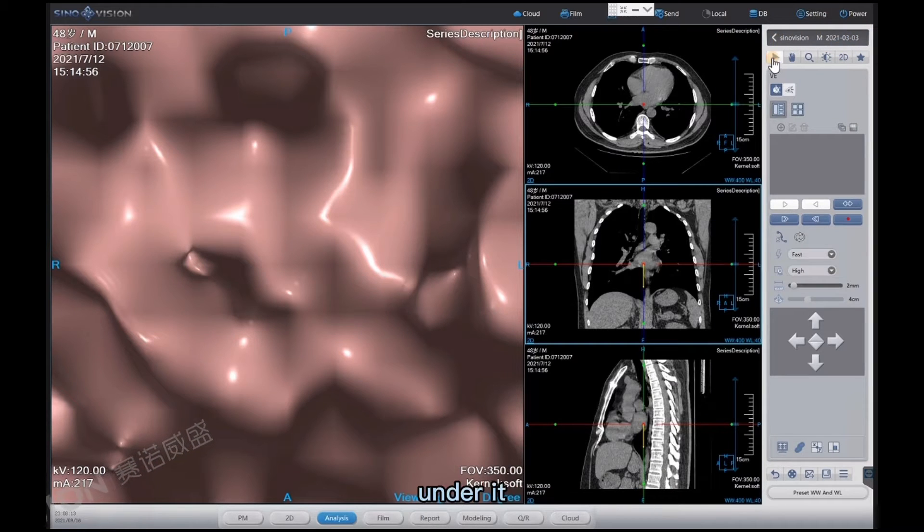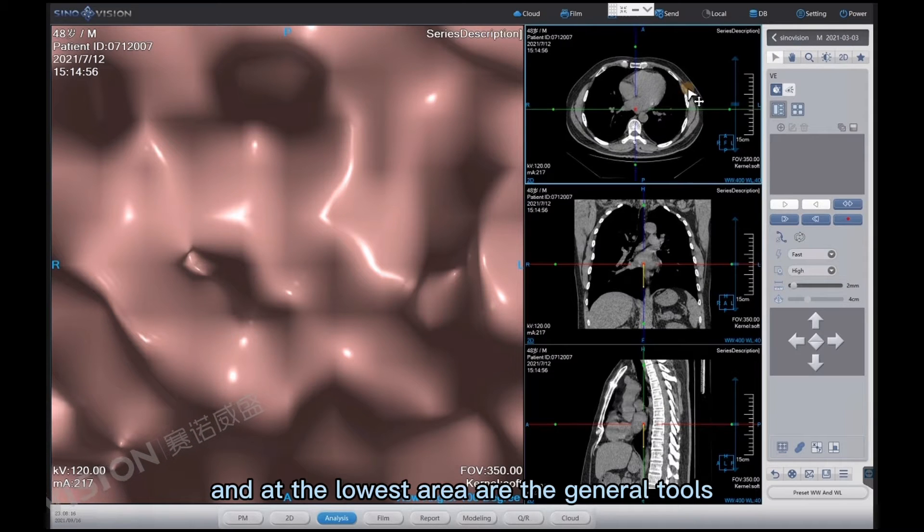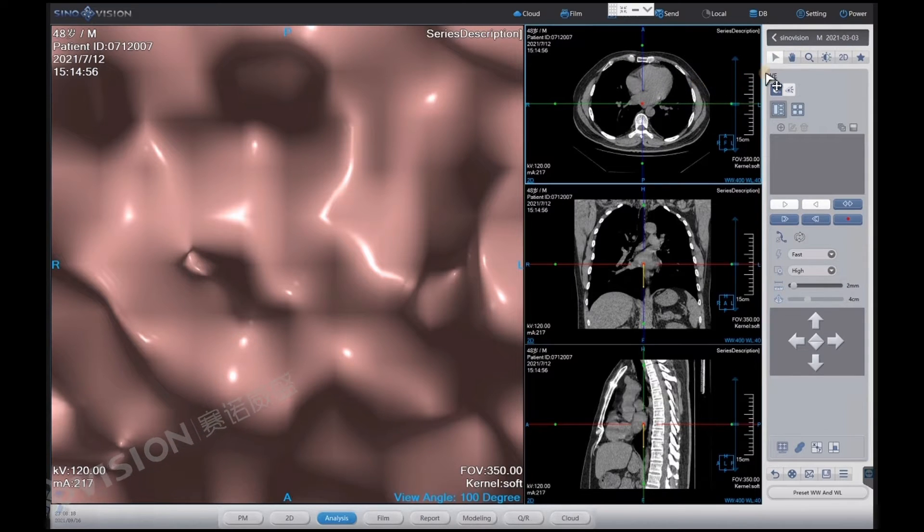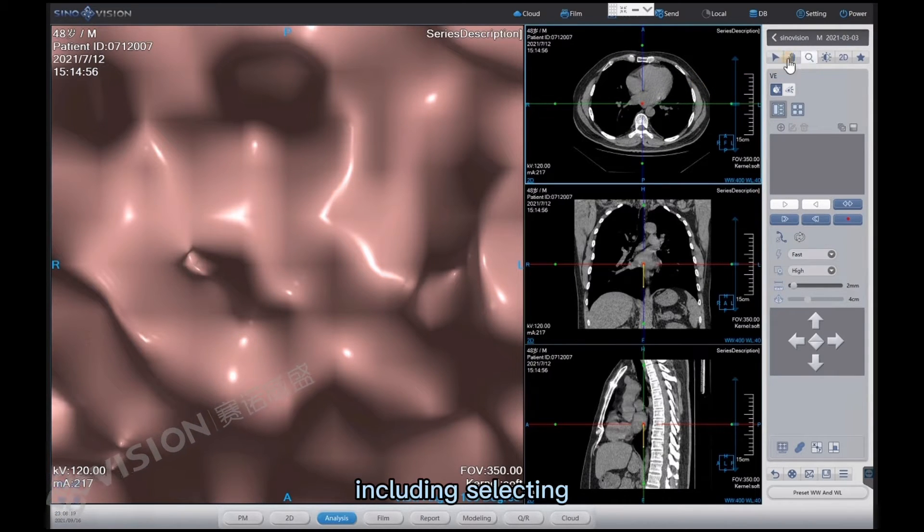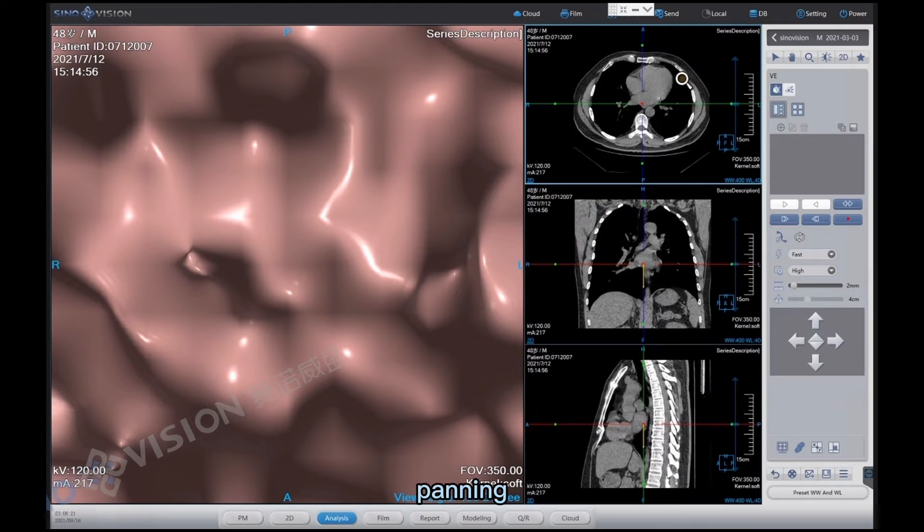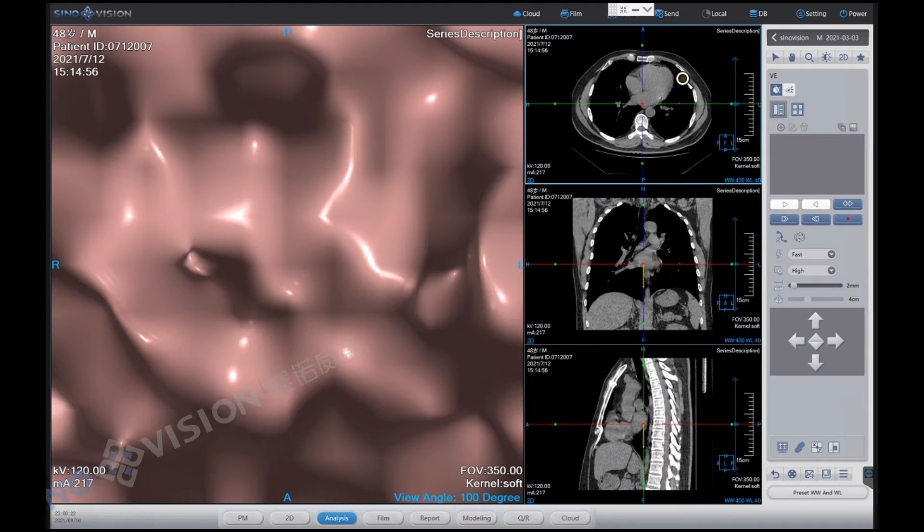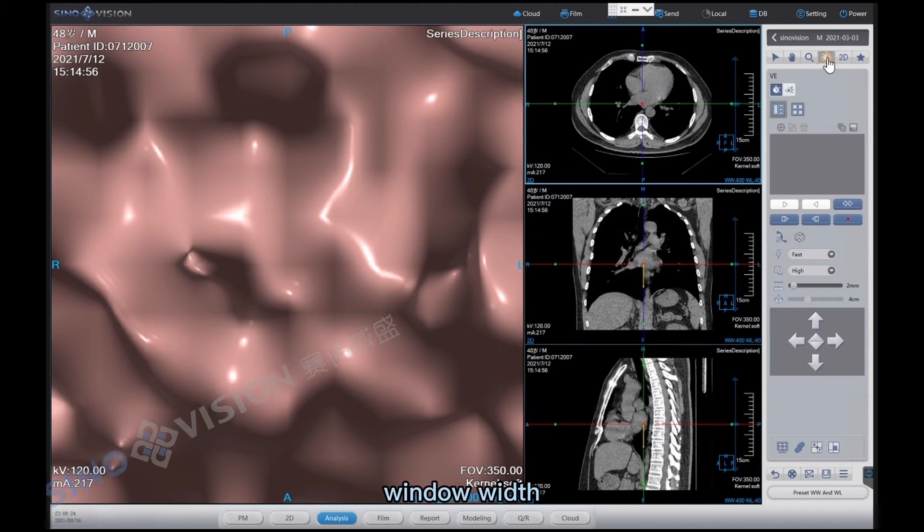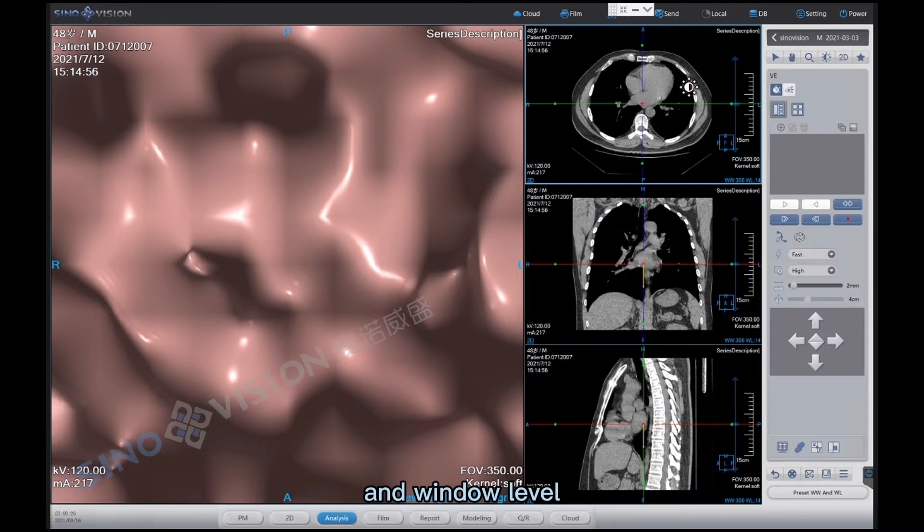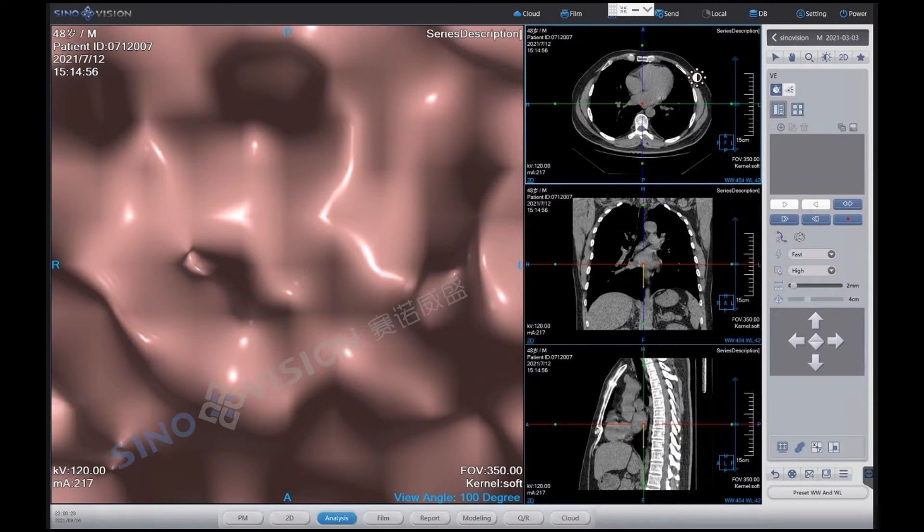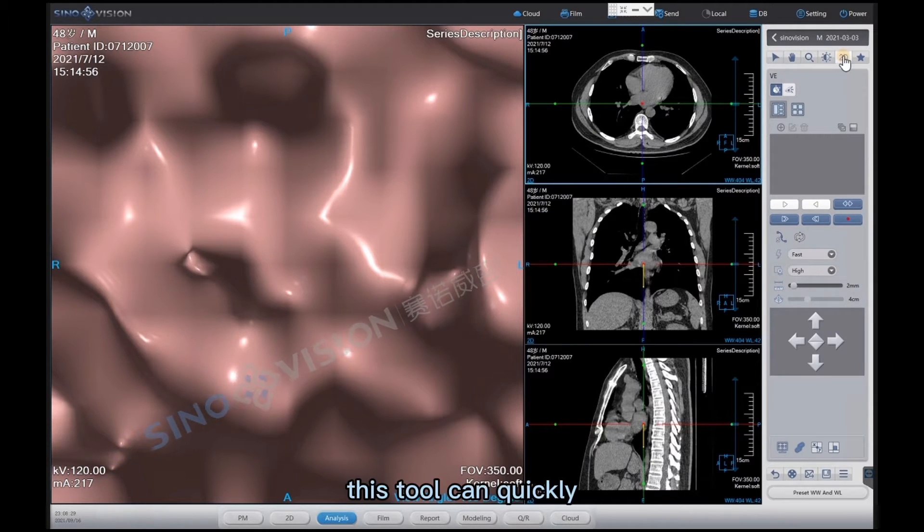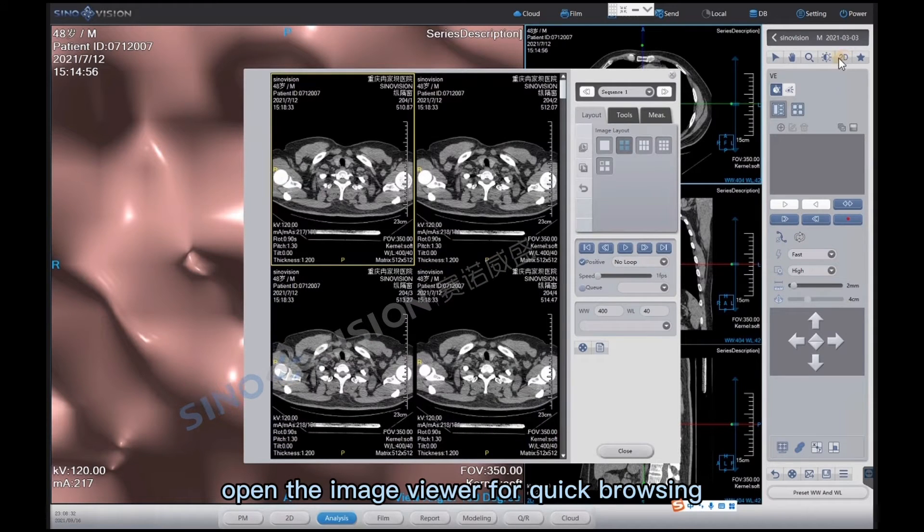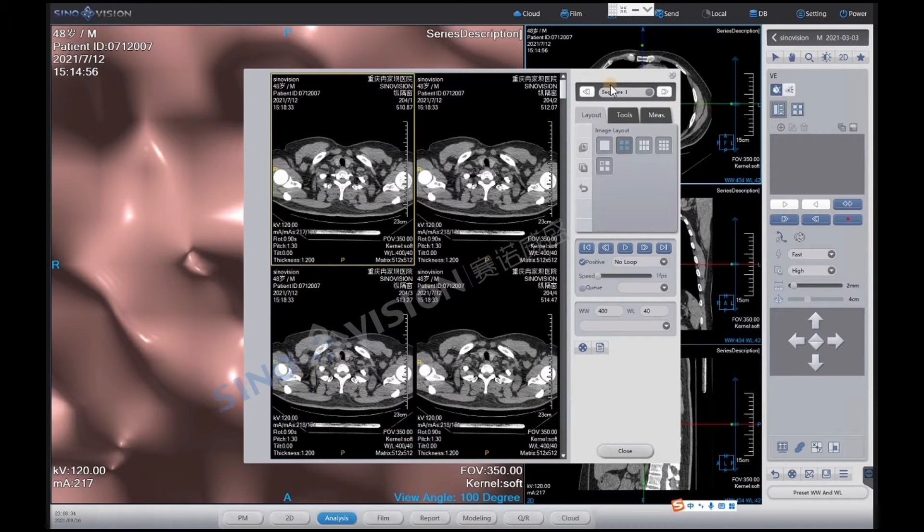Under it and at the lowest area are the general tools, including selecting, panning, zooming, window width and window level, and 2D. This tool can quickly open the image viewer for quick browsing.